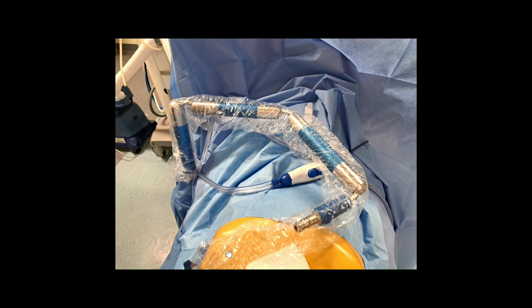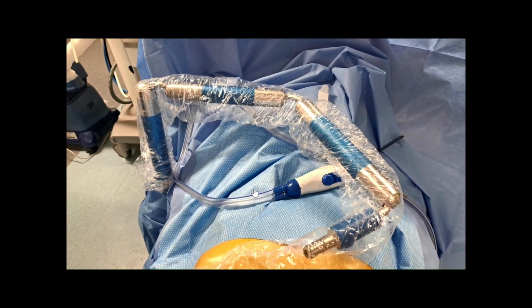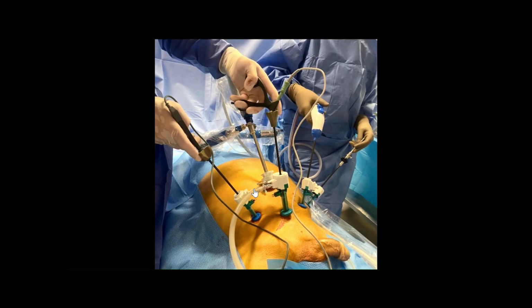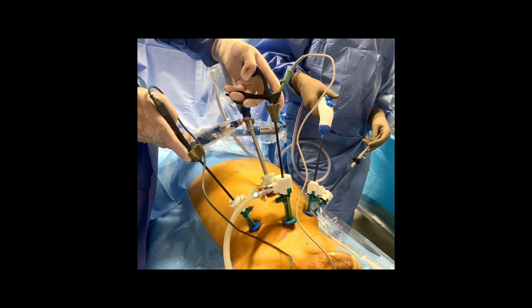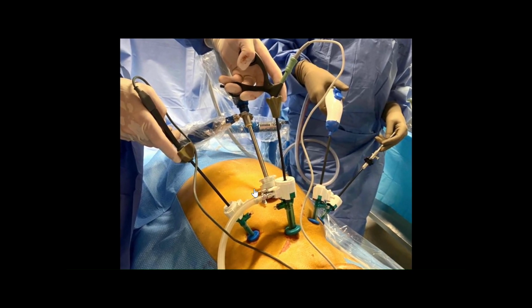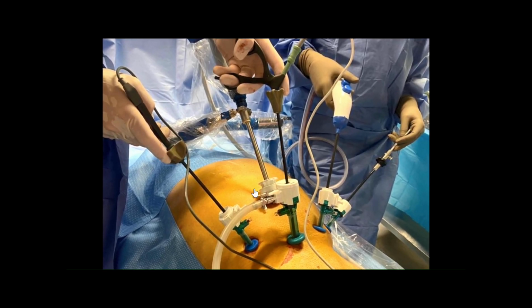This is a pneumatic arm from the Aesculap company. It's under pressure. You have just a small button, and you can place the scope. The scope is fixed, and you can have 4 active hands. That means that you are only 2 surgeons, one surgeon, 1 assistant, but 4 active hands.